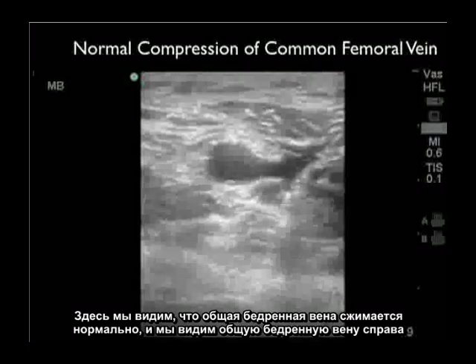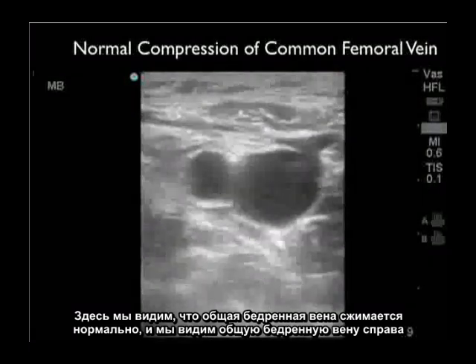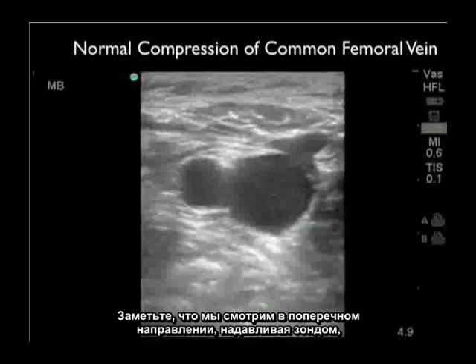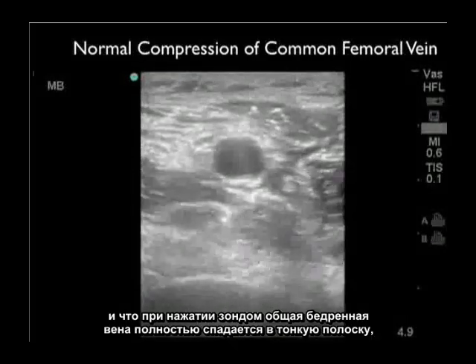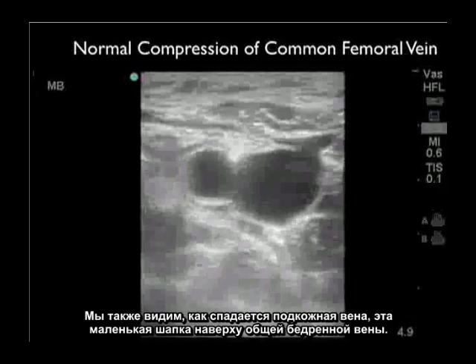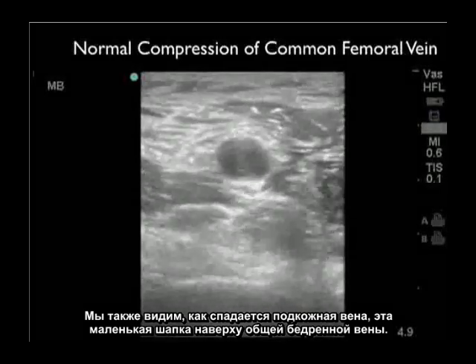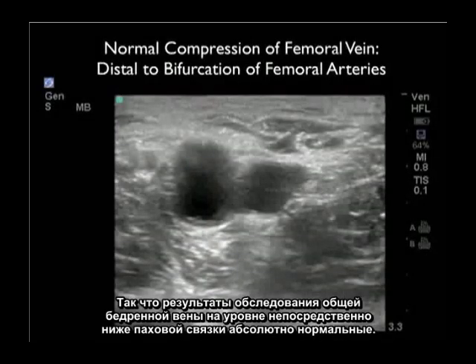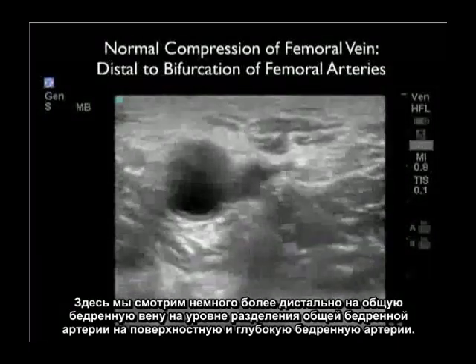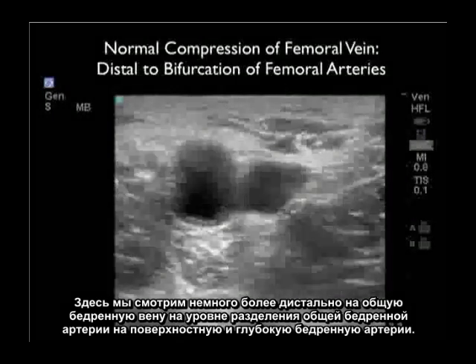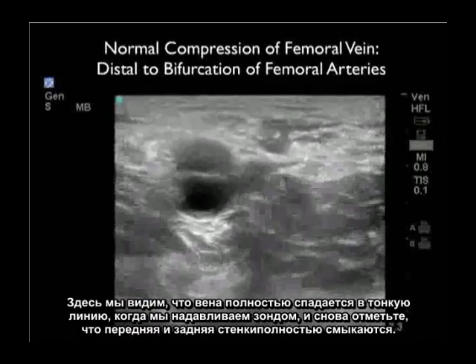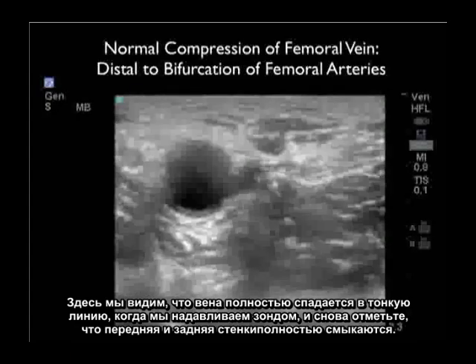Here we see normal compression of the common femoral vein to the right of the common femoral artery on the left. In the short axis or transverse orientation, pressing down with the probe, the common femoral vein completely collapses — the anterior and posterior walls of the vessel meet. We also see compression of the saphenous vein, that little cap on top of the common femoral vein — a completely normal exam just below the inguinal ligament. Looking more distally at the level of bifurcation, we again note complete compression of the vein with anterior and posterior walls completely meeting.